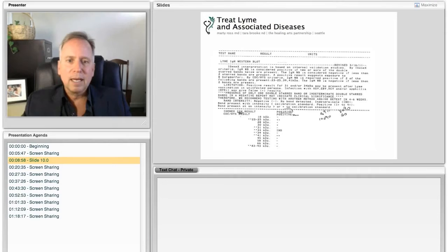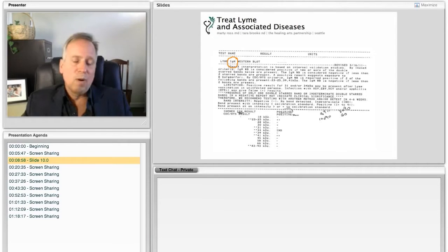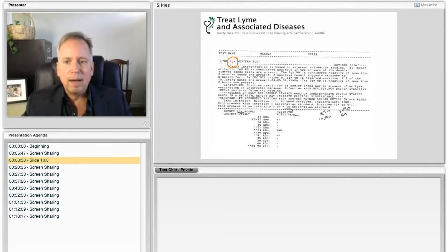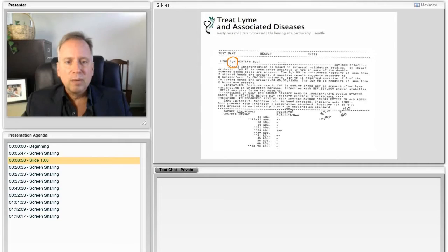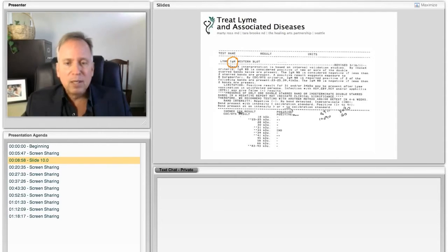So this is an IgM Western blot. I'm circling the IgM right there. And this was for a patient that, again, I've cut their name off. There also is something called an IgG Western blot.